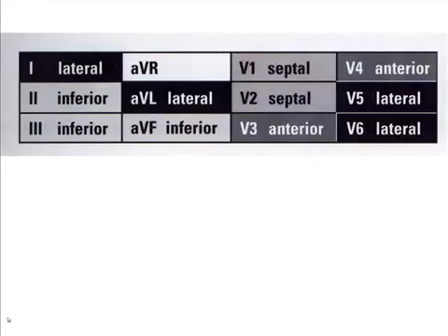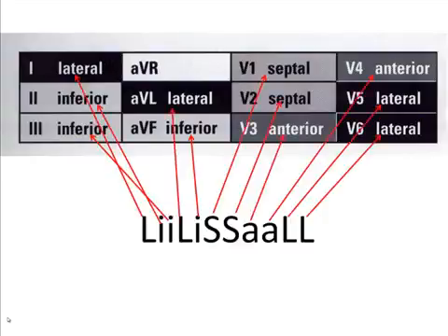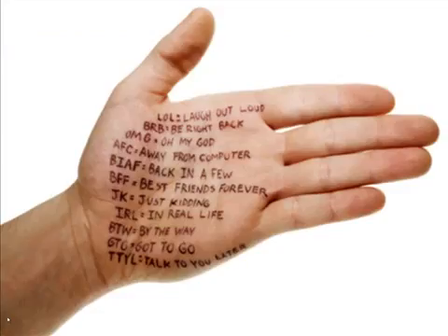Before we talk about Advanced 12 Lead, we need to review a few basics, like what leads look at. However you remember the lead views, whether it be the Lateral-Inferior-Septal-Anterior method or memorization of the 12 lead table itself, there should always be a way that you can quickly recall the 12 lead views and locations. If you cannot recall this from memory, you need to develop a method to do so.